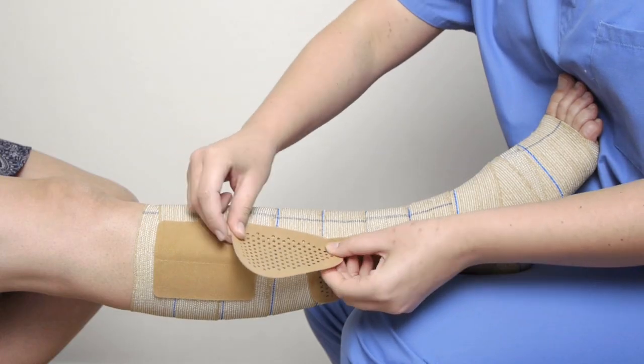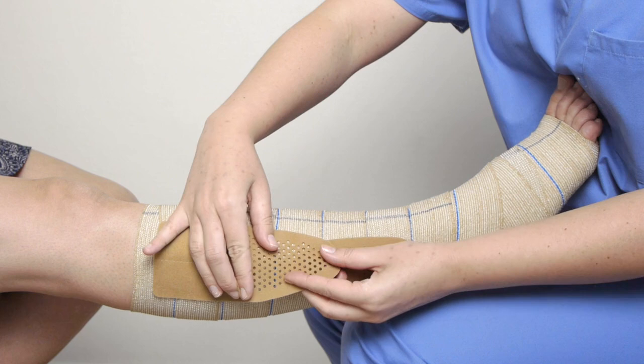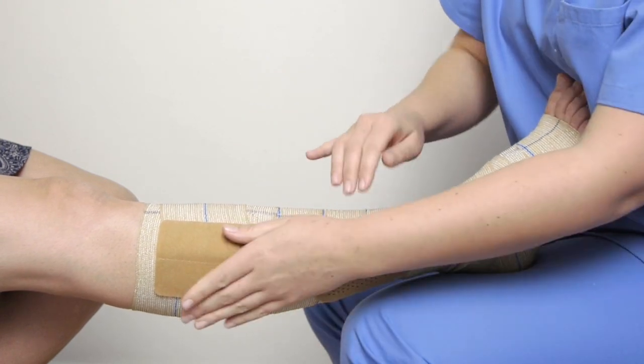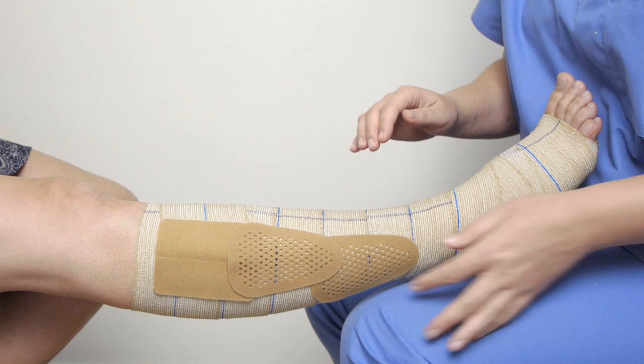Stretch them slightly during application to avoid any air pockets between patch and bandage. Do not cover the press lock — it also functions as a patch.